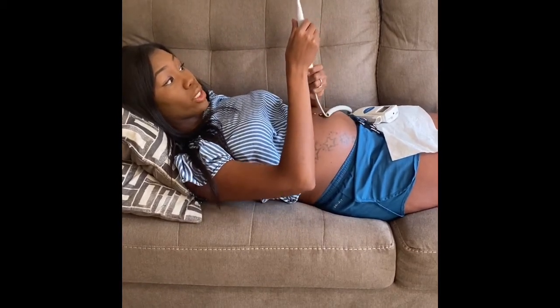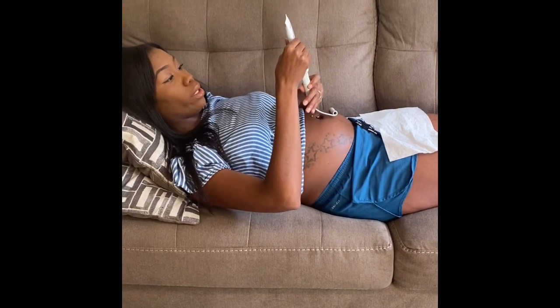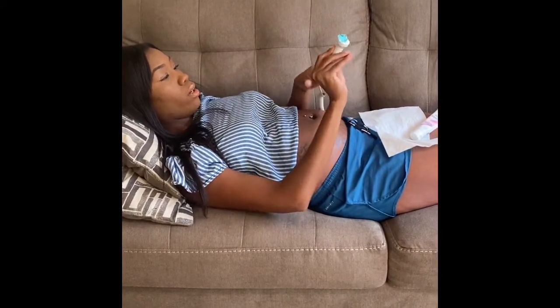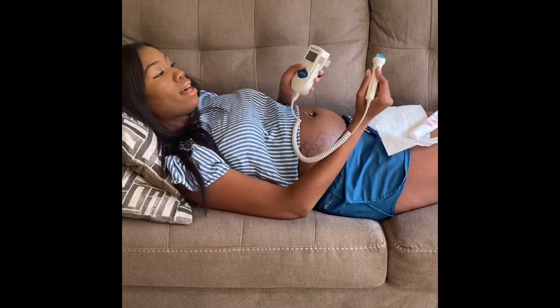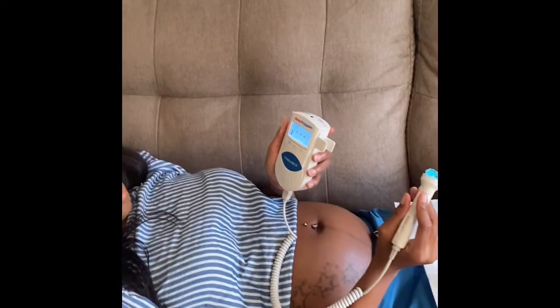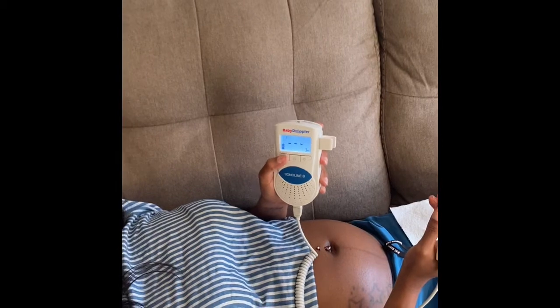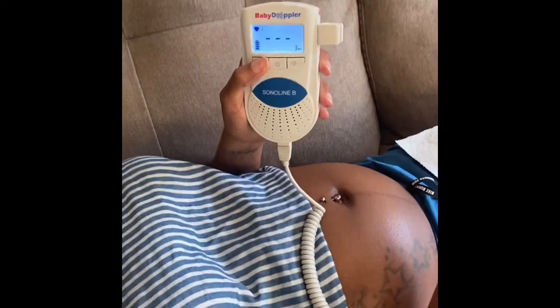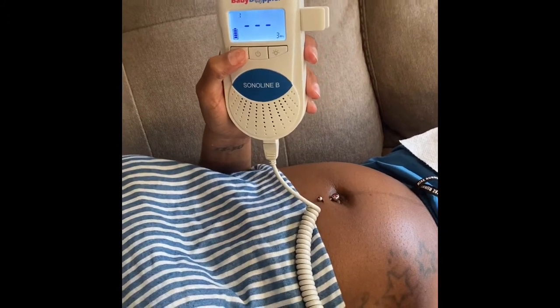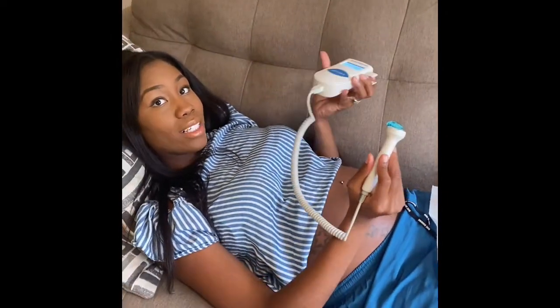I like to put my gel on before I turn it on because, like I mentioned in the video, it does get really, really loud. So just put some on there. Oh no, I hope it doesn't fall. And then I turn it on. I had the volume all the way up for the sake of this video, but normally I don't have the volume that up. And we are on frequency 1. Remember, I told you you have different frequencies. So that's 1, 2, 3. I'm gonna go back to 1 because that's what I'm used to. And that's the loud noise that I was telling you about.